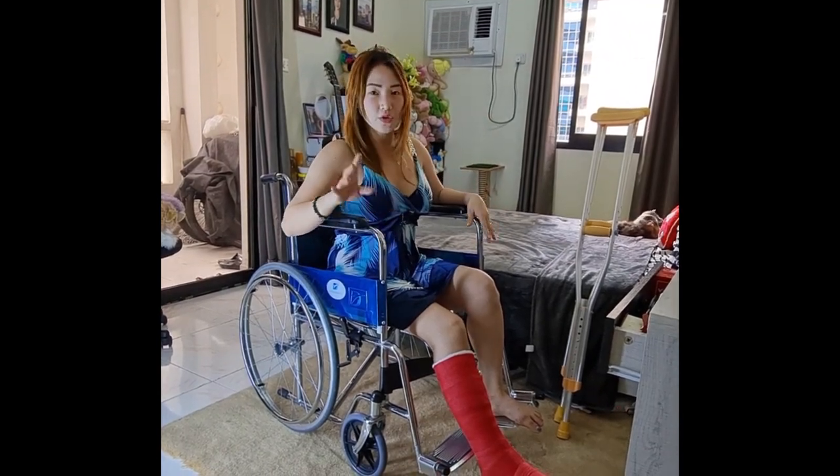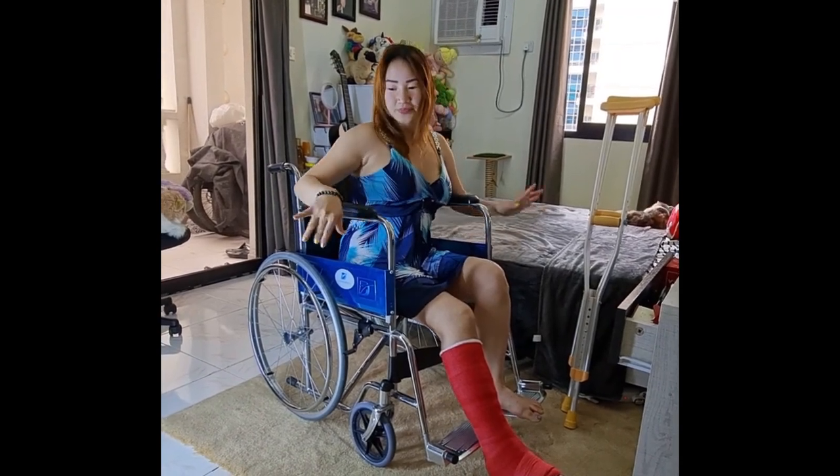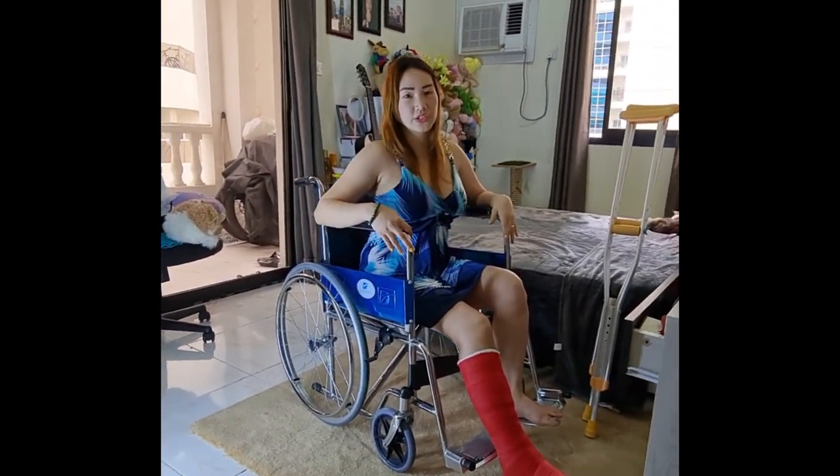Every time when I'm stopping or pausing, I should lock this one to avoid any rolling or loss of balance of the wheelchair.